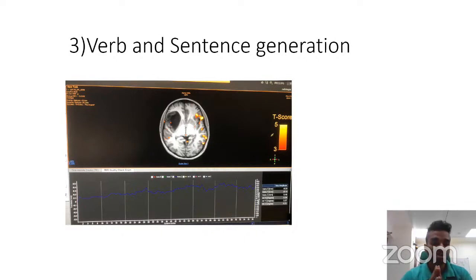After post processing, even this is a really good sign. The patient has a lesion in the right side of the brain, but in this individual his thinking process is mainly controlled by the left side. See, activation in the left side and lesion in the right side, which means the probability of damage to his thinking process with surgery is really less.